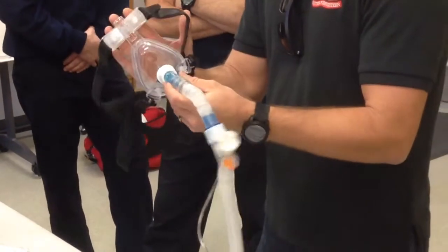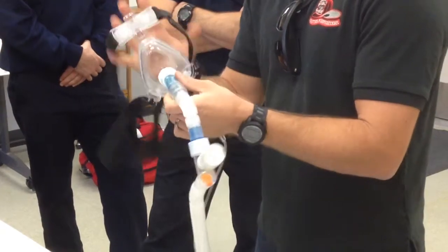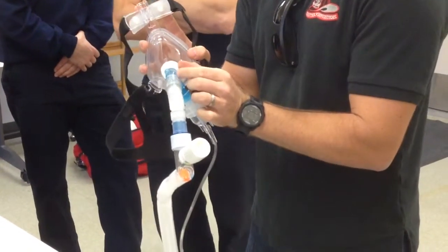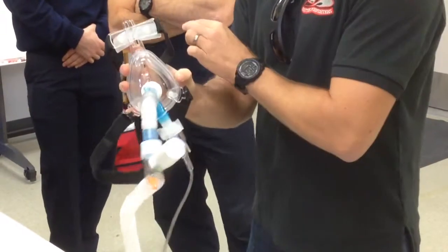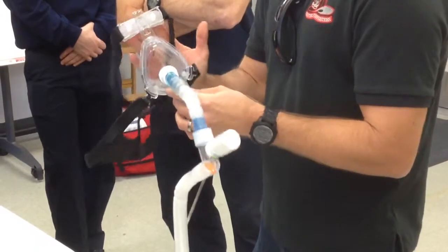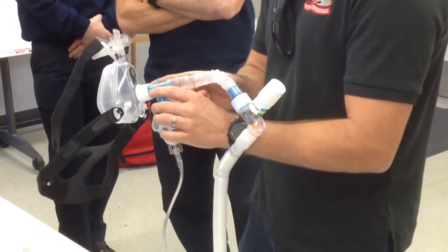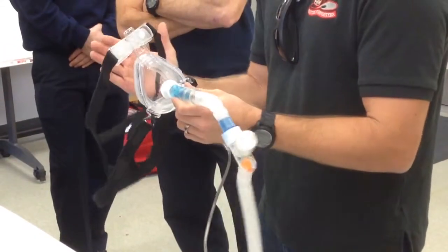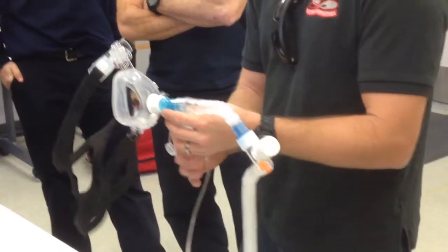So the back pressure: they breathe, stop. Every time they stop, this chamber is filling up with aerosolized medication. When they take a breath, it clears that. So if you don't give that back pressure time to fill up with aerosolized medication, they're just breathing oxygen, which is good for them, but they're not getting any medication.